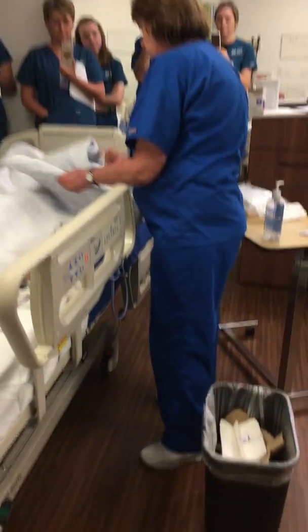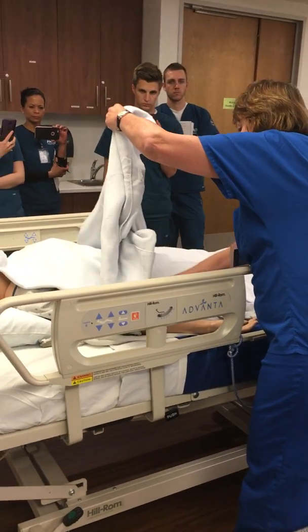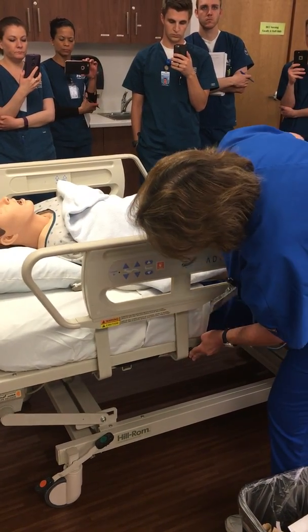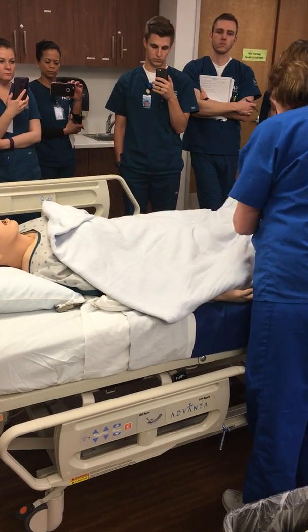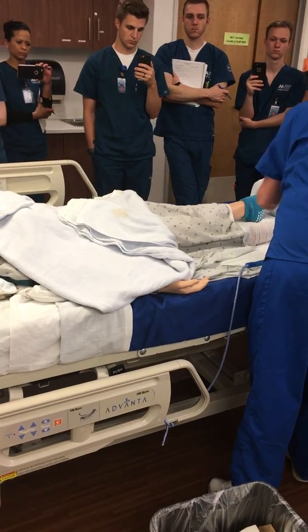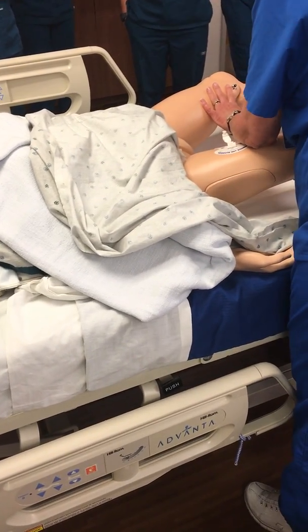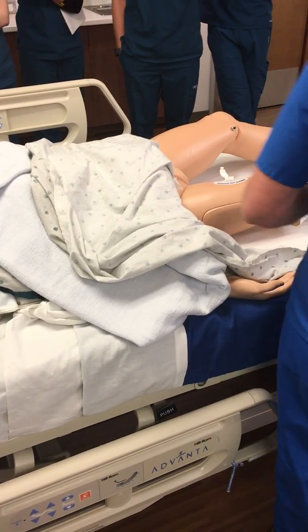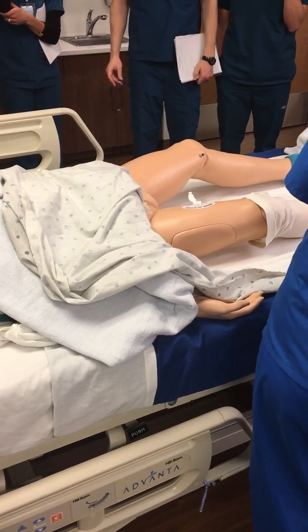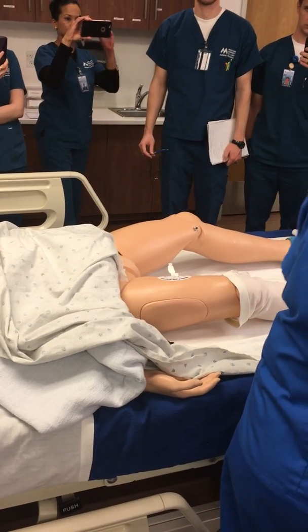So now what I want to do is make sure my patient is comfortable. So I'm going to take my extra bath blanket — it's in a diamond shape — and place that over. I'm going to come in and grab my other bath blanket underneath to make sure my patient stays comfortable. One of the first things I have to do is get your legs situated for me. I'm going to spread those open and have you just let them fall open. Make sure you give yourself a wide enough space to work in here. I'm going to go ahead and put my gloves on.